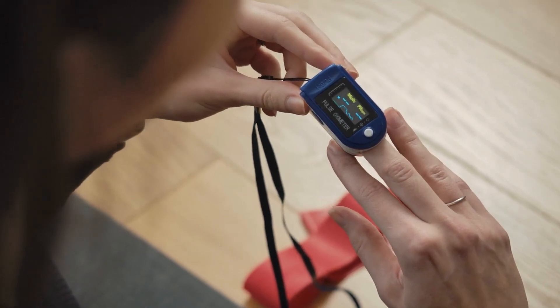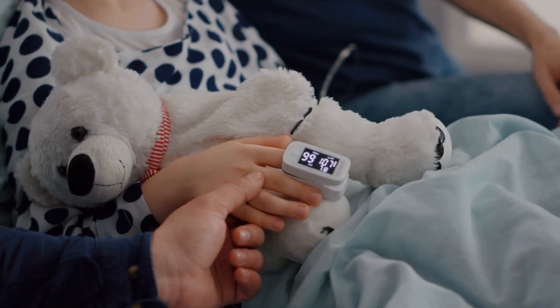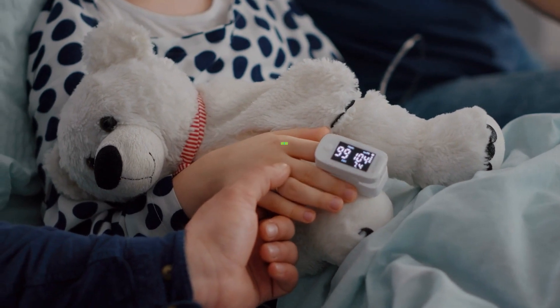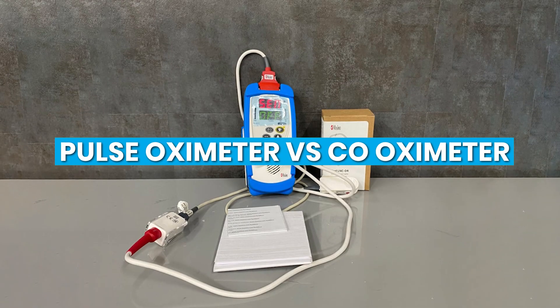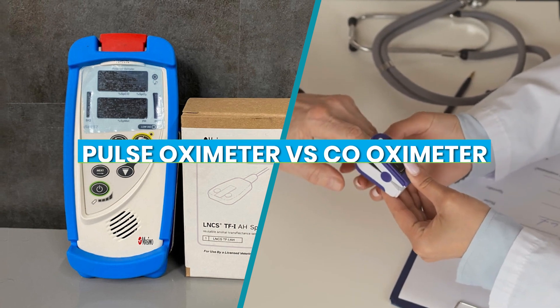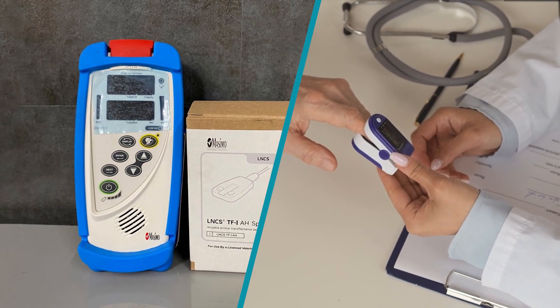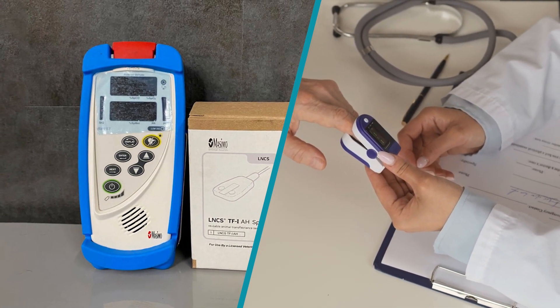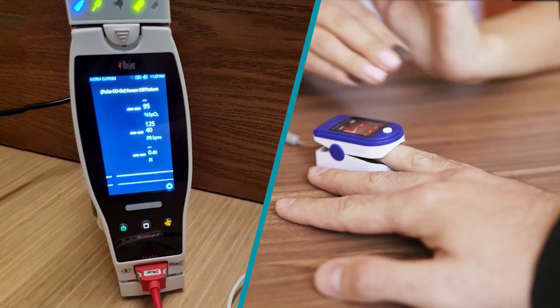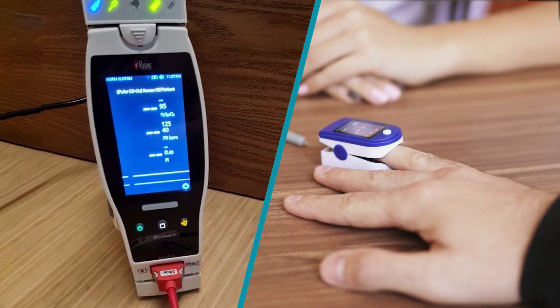Hello and welcome. In this video, we will be discussing two types of medical devices used to measure blood oxygen levels: pulse oximeters and co-oximeters. Both devices are important tools for monitoring patients in a clinical setting, but they differ in their capabilities and applications. We will go over what each device does, how they work, and the potential benefits of each.